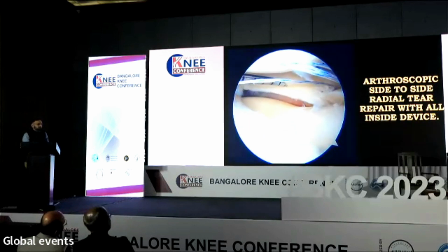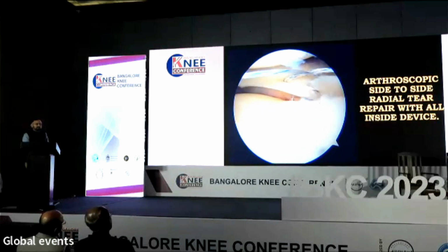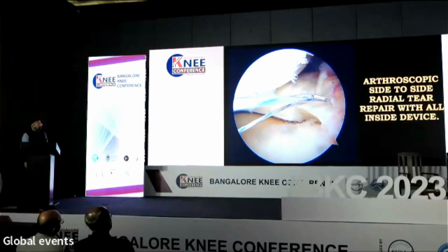Safe zones of the meniscus have to be kept in mind when you're using these all inside devices. The lateral meniscus usually is pretty evident in a figure of 4 fashion, but for the medial meniscus, as described in the previous talks, pie crusting is essential to see the entire depth.